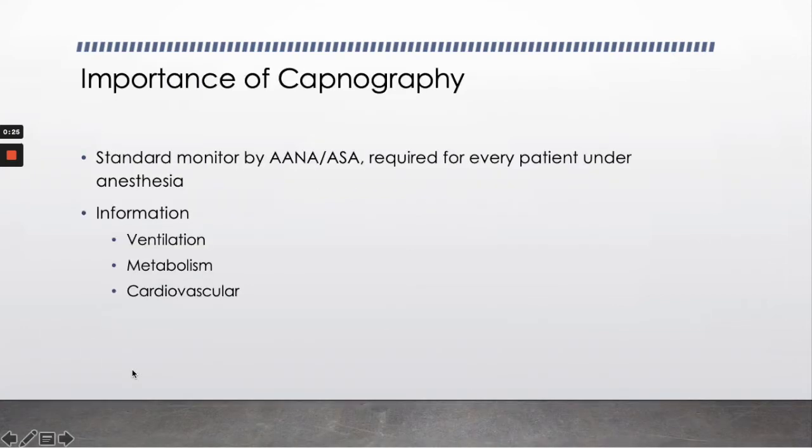All right. So the importance of capnography: it's a standard monitor that's required by the AANA and ASA, and it's required for every patient under anesthesia. So it doesn't matter whether it's general or it's considered a MAC. If you're just using a nasal cannula, that can go back and forth on how people consider it general or a MAC depending on what type of anesthetic you're using. You always need to monitor capnography no matter what.